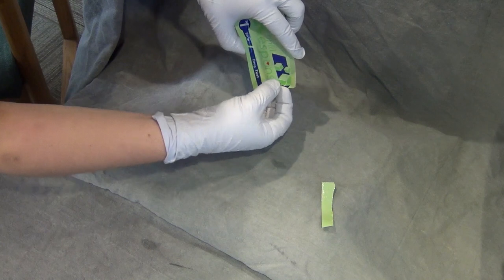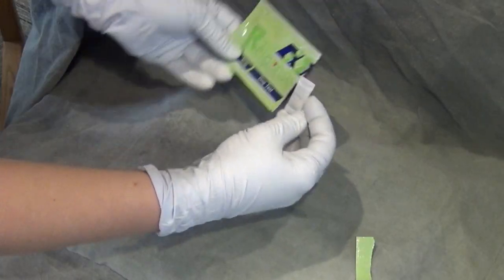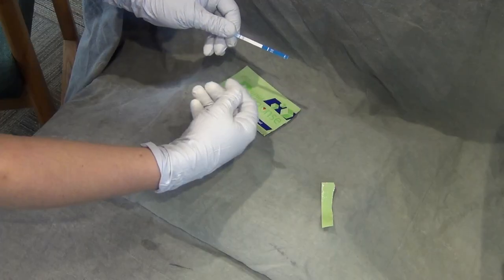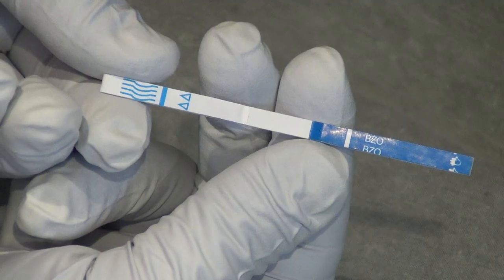Once your sample is ready for testing, you may open the package. You will see a silica gel packet that can be thrown away. You will also find a long skinny strip with two distinct halves.